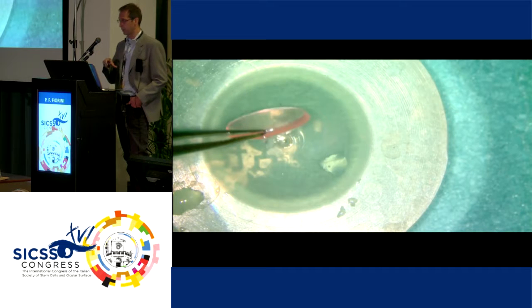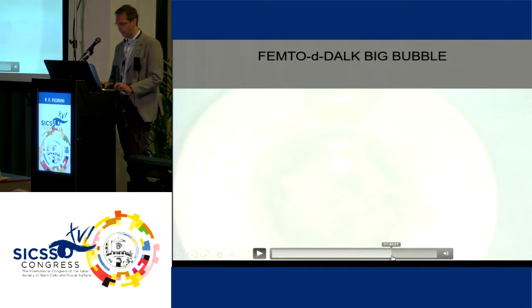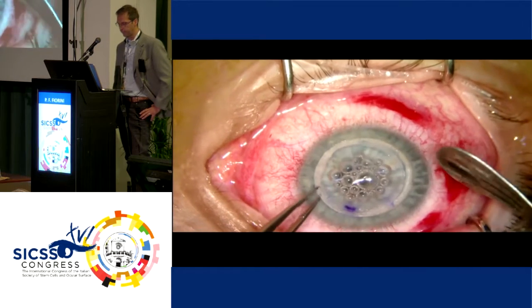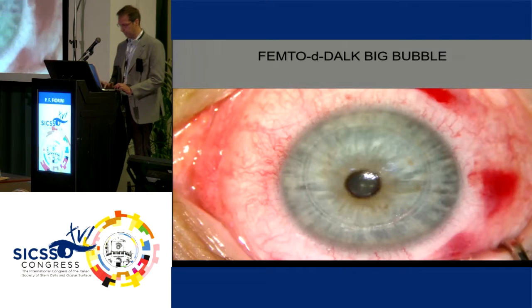Going back to the lamellae with the manual trephine after having used the femto laser for some time is really embarrassing, I might say, because the cut with a laser is so perfect, and you can have it made coplanar with the recipient cut, that you will really feel like not applying any suture stitch. You may see how the two structures are interfaced. One feels like no suture should be applied, but of course we have to suture.